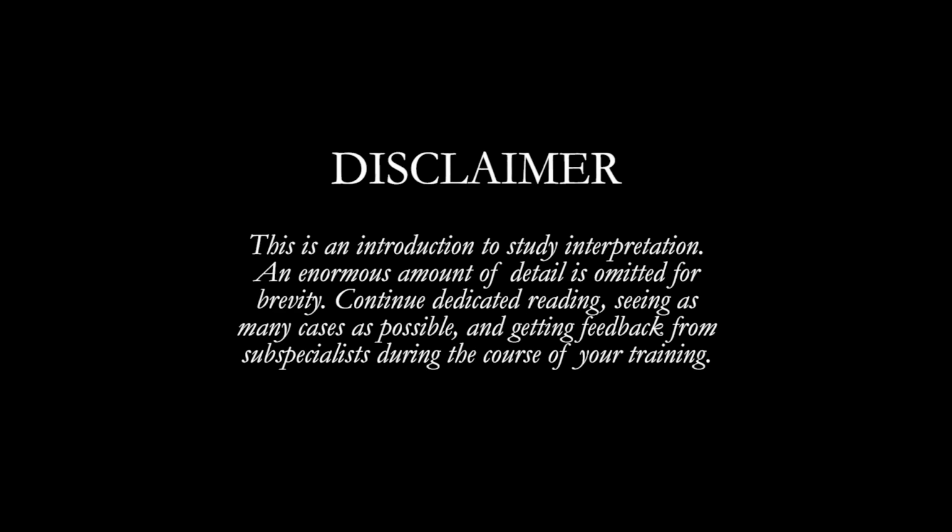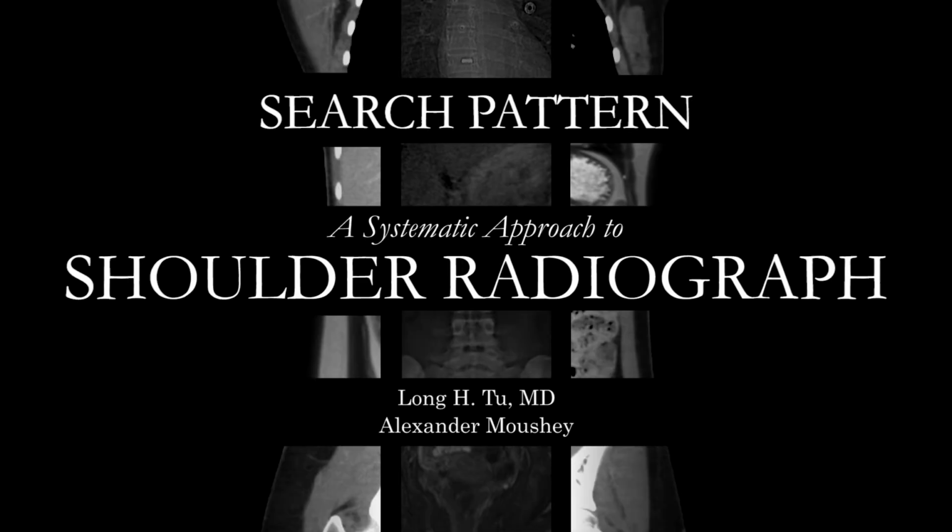Please note that this is an introduction to study interpretation. An enormous amount of detail is omitted for brevity. Continue dedicated reading, seeing as many cases as possible, and keep getting feedback from subspecialists during the course of your training. So today we're going to be talking about a basic approach to the shoulder radiograph.